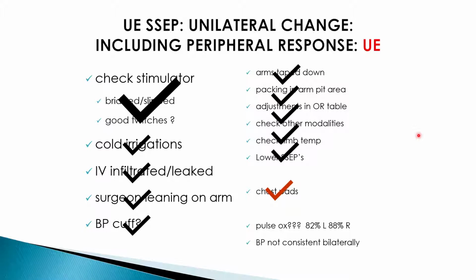We decided to look at those chest pads of the new bed that we had just gotten. It's important to mention also that the pulse ox on the hand was reading in the 80s, and the blood pressure was very inconsistent from reading to reading.